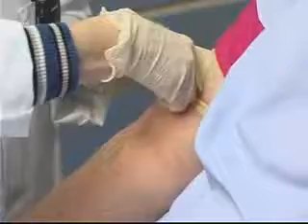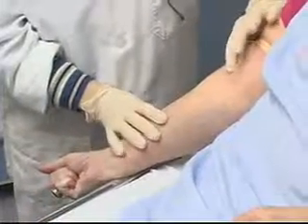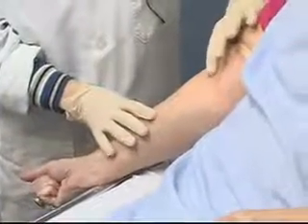The site I've chosen is the antecubital, so I'm going to apply the tourniquet to the arm approximately three inches above the antecubital fossa. I'm going to ask my patient if she'd please make a tight fist for me, and I'm going to feel the area — I can feel that vein.